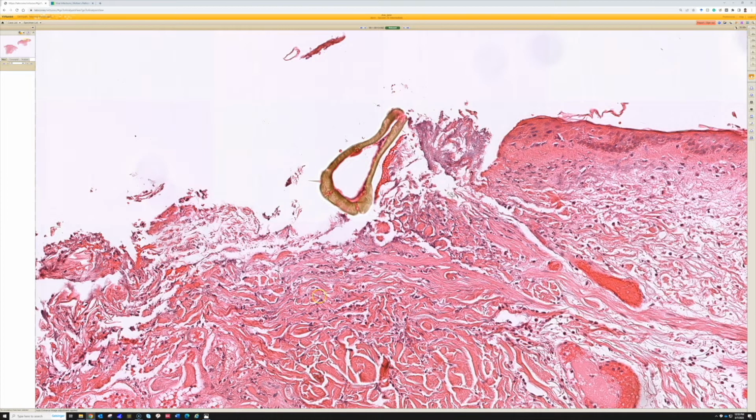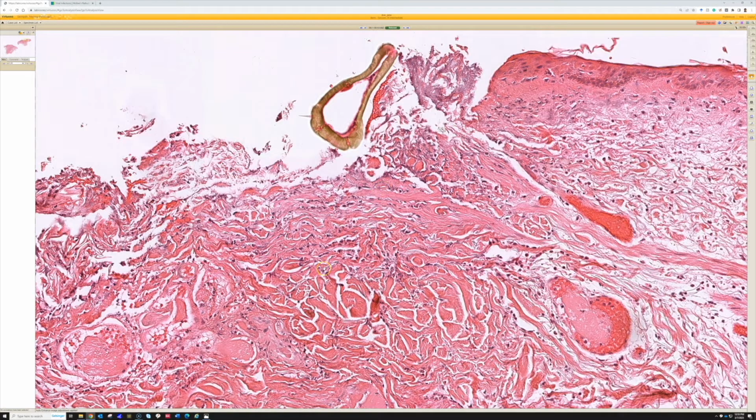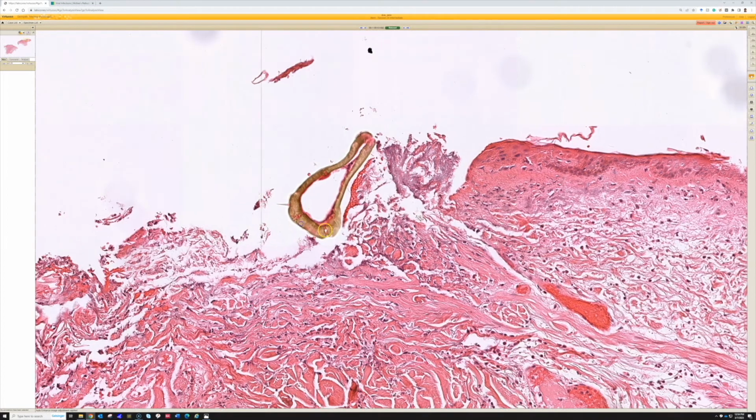I find that you often see variable amounts of inflammation with eosinophils around the tick mouthpart, and particularly in that wedge shape that's typical of arthropod bite reaction. And it does get this smudgy pink look and kind of necrotic, fibrinoid-looking dermis. So if I ever see bug bite reaction with this smudgy pink dying area of dermis, I'll often cut deeper and look, hopefully, to find a tick mouthpart on the deeper sections. So if you get lucky, you'll find one, all right?